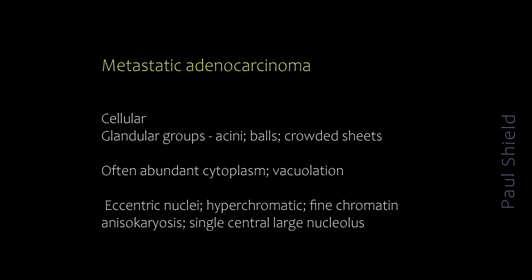So that's the most common pattern really, the classic adenocarcinoma pattern. And that accounts for the vast majority of metastatic adenocarcinomas in effusion specimens. However, there are a group that show different and more subtle changes, and that'll be the subject of the next clip.